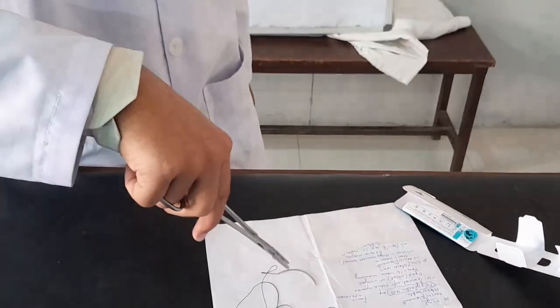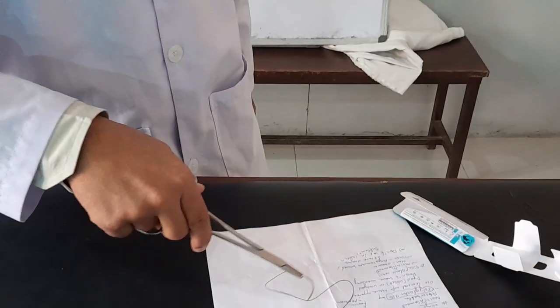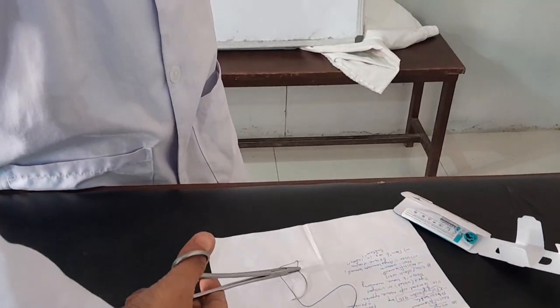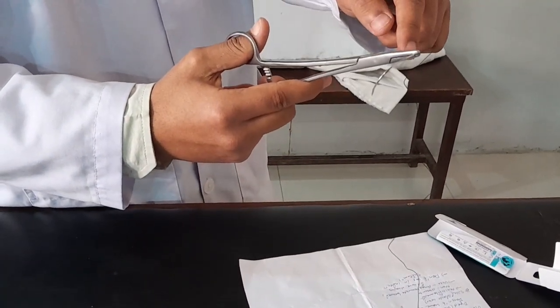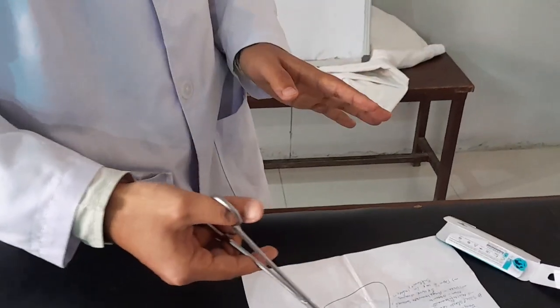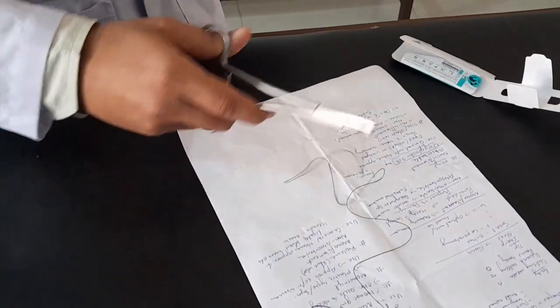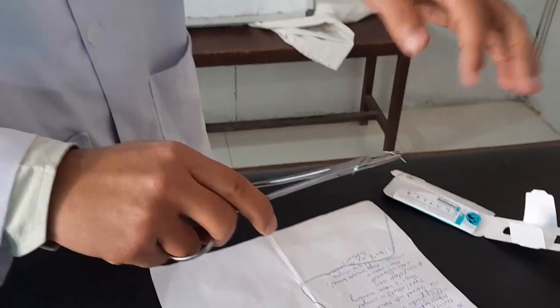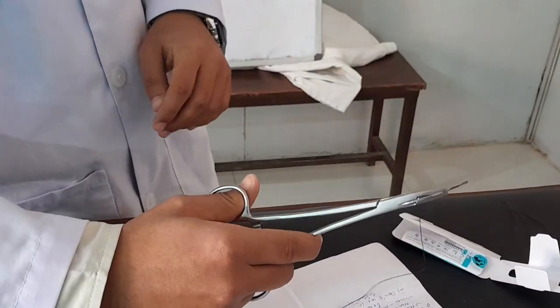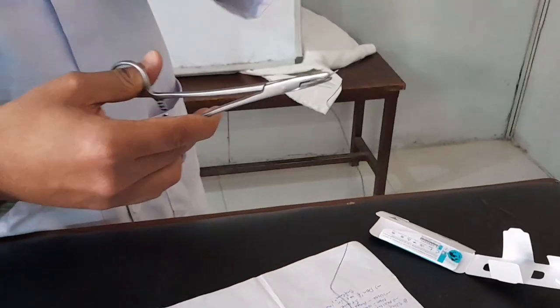So it's better to hold it from the base and not like that, because while you're giving it, it is quite risky, isn't it? So one thing you can do is place it near the base, and it's better for the needle to face inward. Suppose this goes, I'm manipulating it with my hand. If it is going inward to the needle holder itself, then there will be less chance of trauma. So while giving, you can pass it. This is one way.